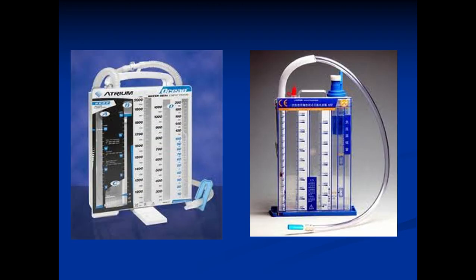In this picture, this line is connected to the chest tube coming from the patient, and here we put some water, so this is the underwater seal, and here is the level of the water suction. I mean the level of the water according to which we calculate the suction amount, and the suction is connected to this one. So the suction is connected to the bottle itself and not to the tube coming directly from the patient.